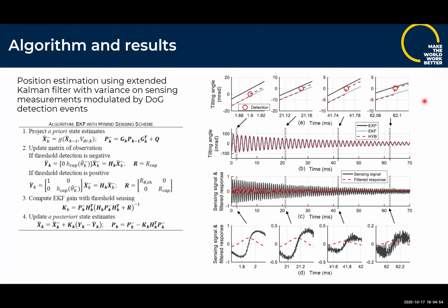But even this is a sort of cheating demonstration because the other reason, not just to manipulate the amplitude, is this decaying. It's decaying because we are basically turning off the input voltage so it's not contaminating the signal while we're making these estimates.